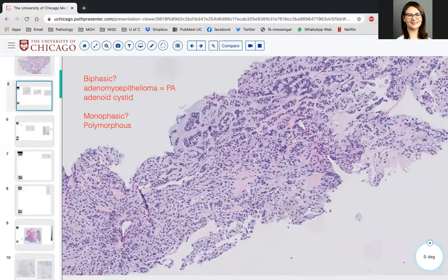So, I can't get back to this one box that I'm in. Here we go. Epithelial myoepithelial carcinoma is another prototype biphasic salivary gland carcinoma. Any type of basal cell neoplasm, right? That is also biphasic, but I think, as Heather said, I agree.